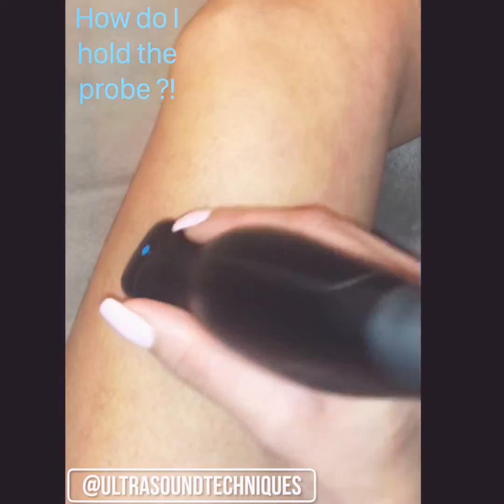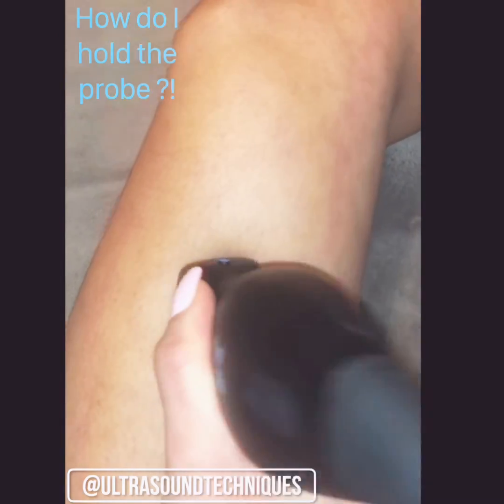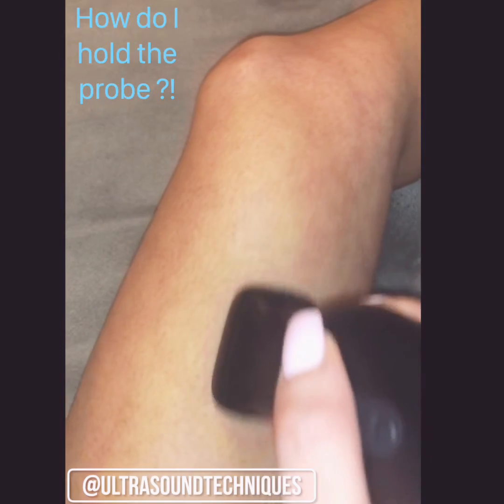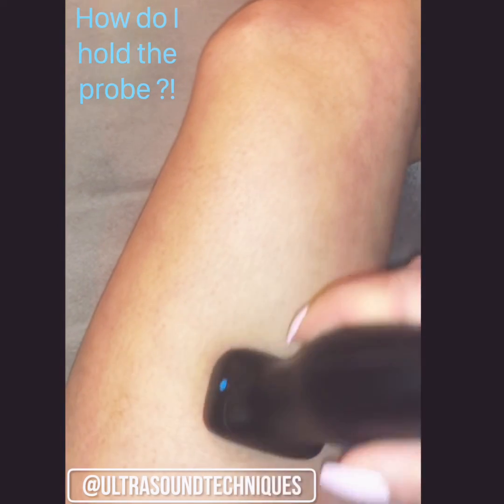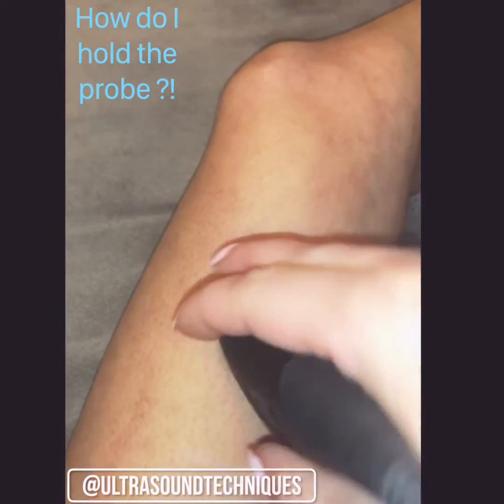This probe is a little bit on the heavier side, so I like to use all my fingers. Just think about how it feels comfortable in your hand to use different techniques like rocking. Also think about the comfort level in your wrist — your wrist plays a huge part in movement. If you're in a position where you're comfortable enough to move without losing the anatomical image, then you're okay.